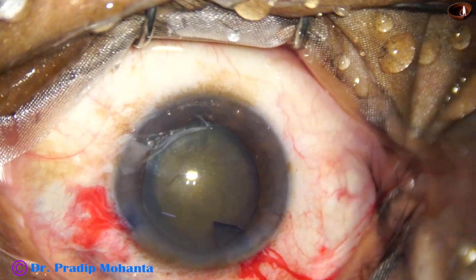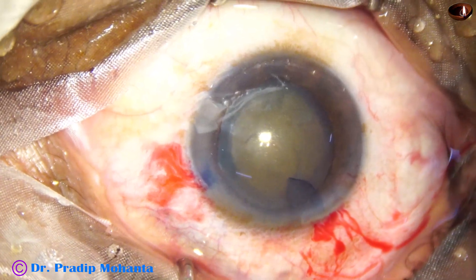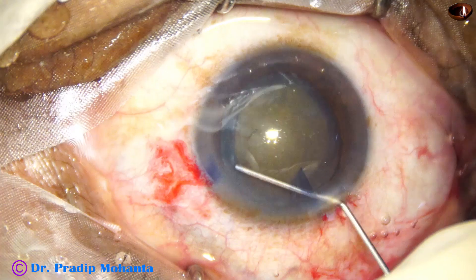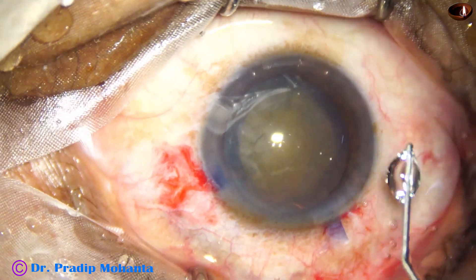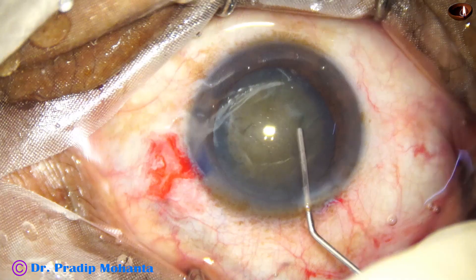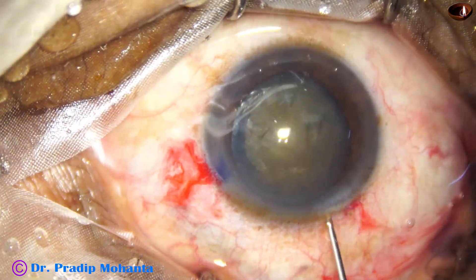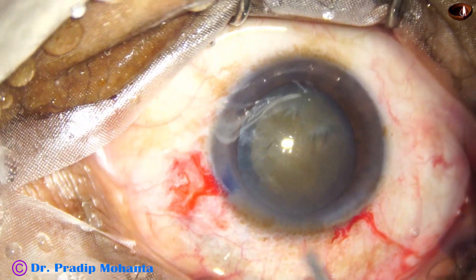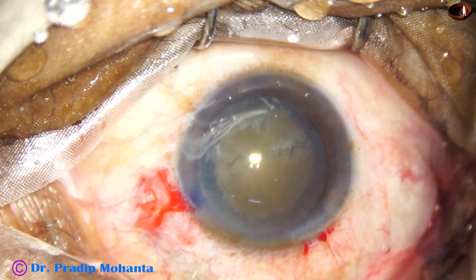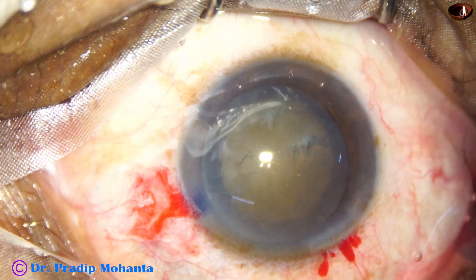Now hydrodissection is done. I use a 27-gauge cannula and BSS to do hydrodissection. Small amounts of BSS are injected, the nucleus is tapped frequently, and then phaco begins.